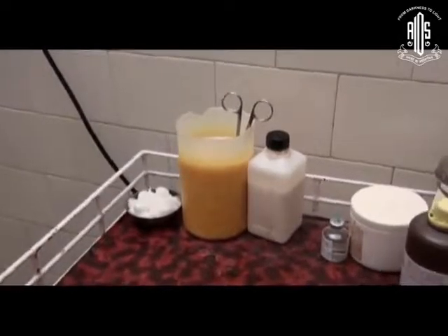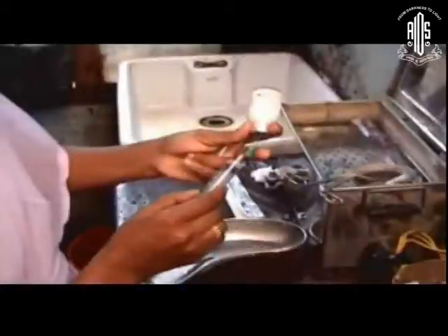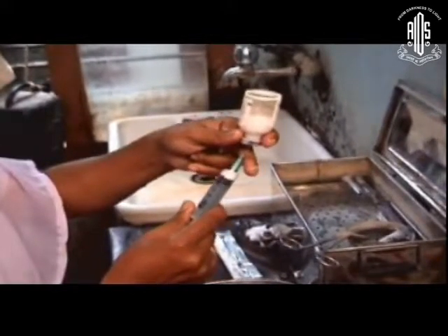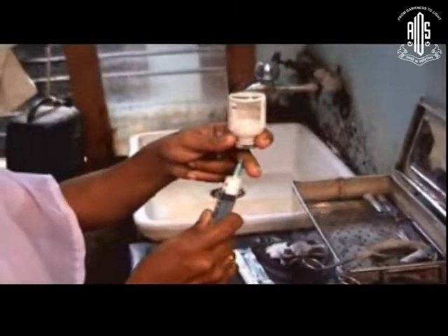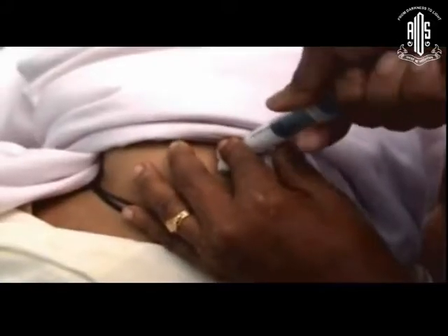Along with food waste, needles are seen discarded together — that is completely wrong. Do not use Cheatle forceps — it will cheat you. Again, look at the way needles have been carelessly discarded. This staff member giving an injection has 25 years of experience, and yet look — she is letting the cloth touch the needle. We need to educate them. Unless we learn, we cannot educate them. She has 25 years of experience but is still not practicing safe injection technique.